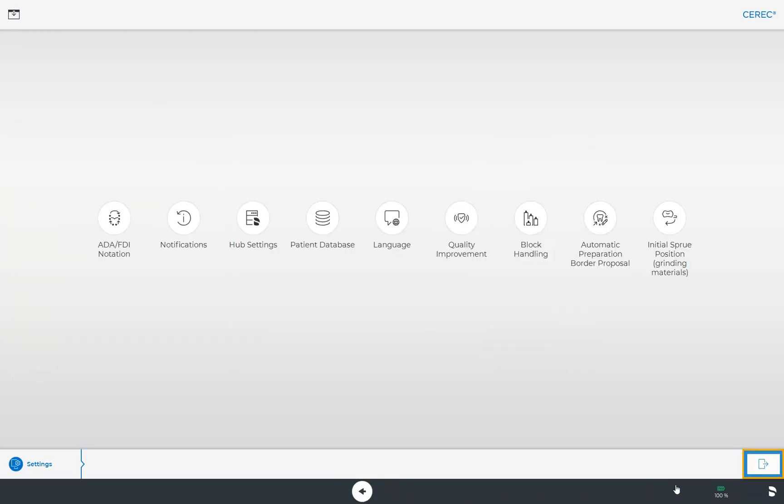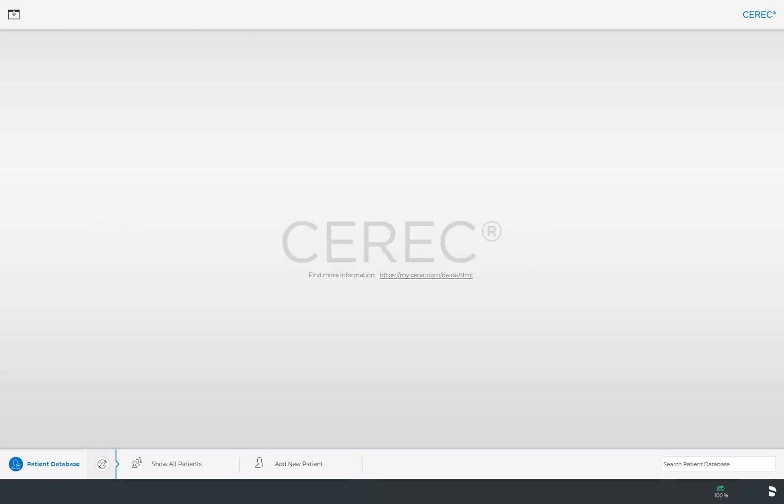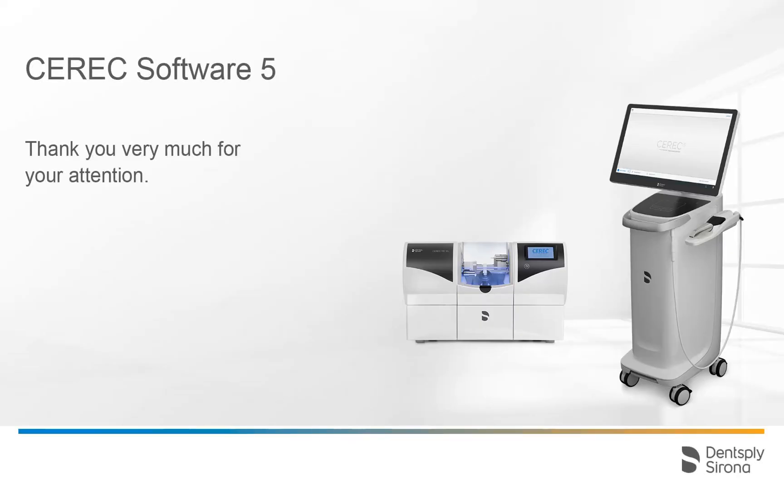Then we close the configuration, which takes us back to the start screen. Thank you very much for your attention. We would like to wish you every success when working with CEREC.